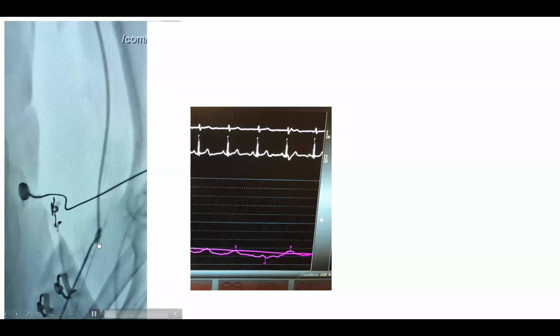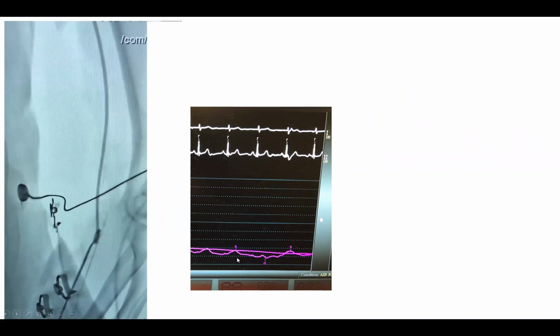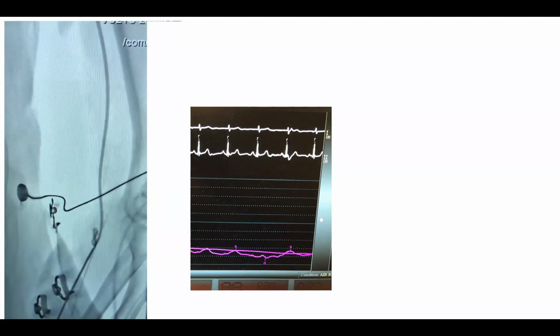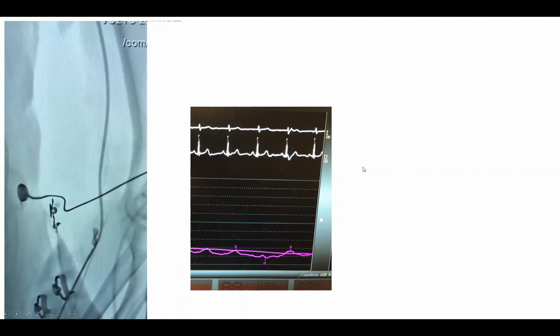So always a reflex: if you're torquing a lot, be obsessed. I may kink that catheter, and watch your pressure tracing. But more importantly, don't let this happen. Put a wire in place and engage with a wire in place. Okay? So those are extremely important ideas that we encounter often.